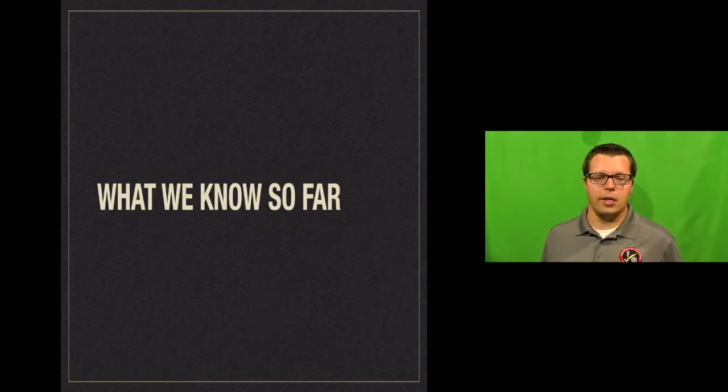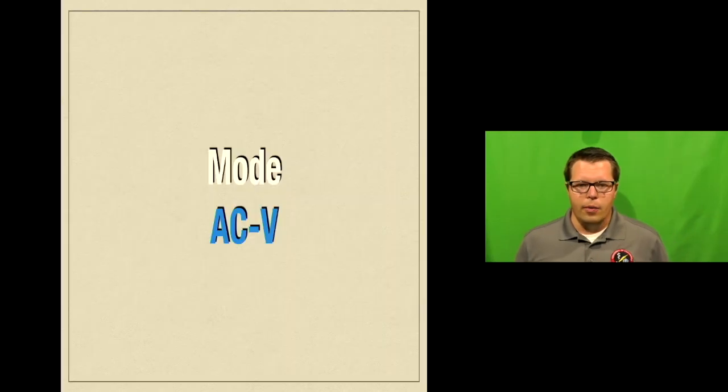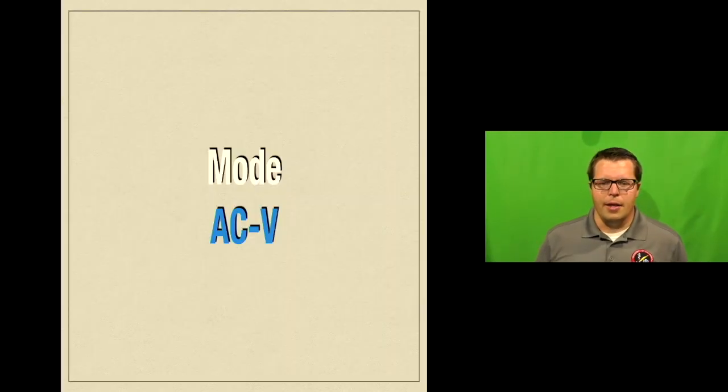So to review all that stuff so far, what do we know so far? What have I talked about? Well, we're going to turn on the ventilator, and unless we have a good reason to do it otherwise, assist control with a volume setting is a great way to get started in terms of mode, and it makes things relatively easy and harder to screw up.